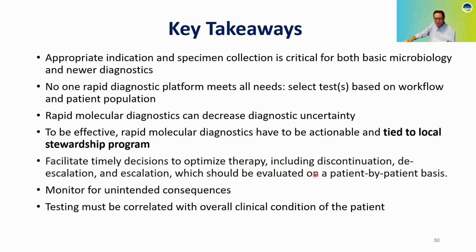Understand timely decisions to optimize or discontinue, again, on a patient-by-patient basis. Monitor for unintended consequences anytime you implement a new test. And testing, again, must correlate with the overall clinical condition of the patient. So your clinical judgment still is important, but these tests can enable us to make more accurate diagnoses.